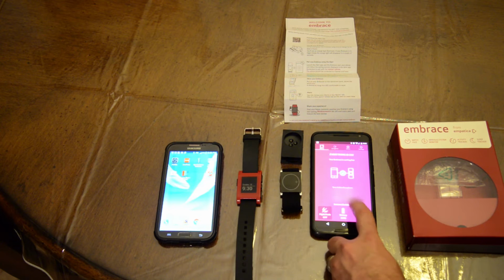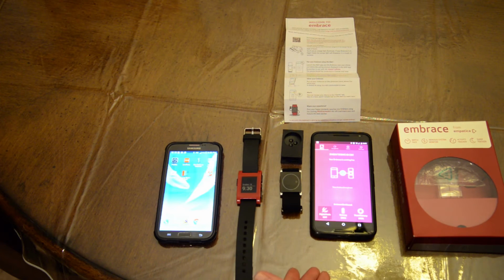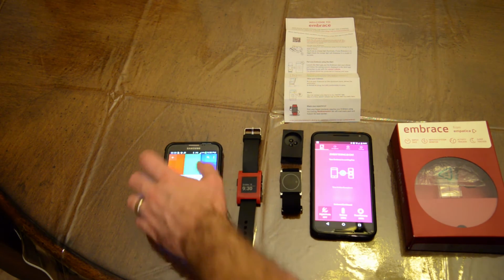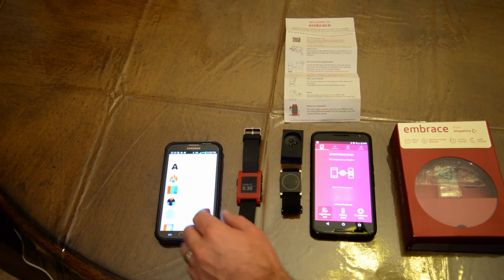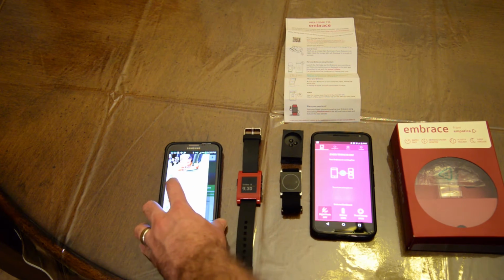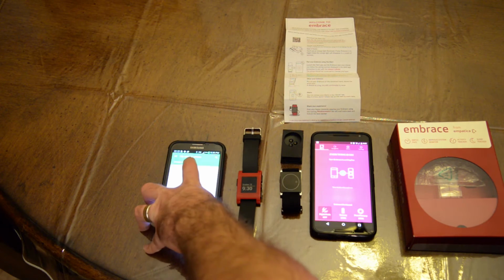As you can see here, I have Caregivers that I've already assigned, myself and my wife. It will grab that from the account online, so if you get a new phone, you'll be able to use it. It's very important to note that this is not really compatible with older devices or tablets as of now.